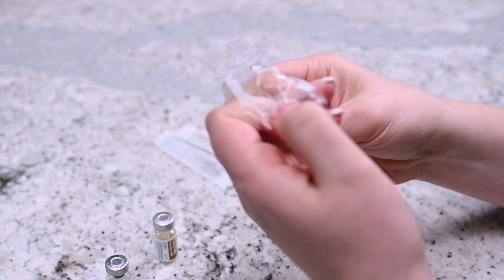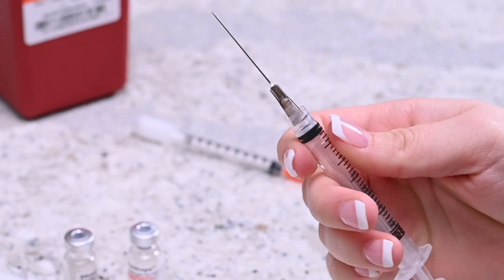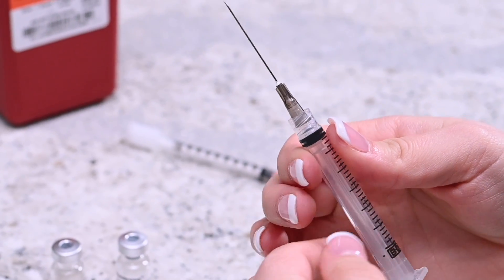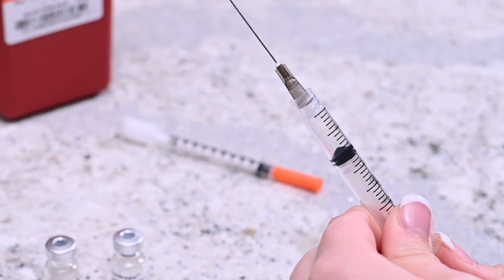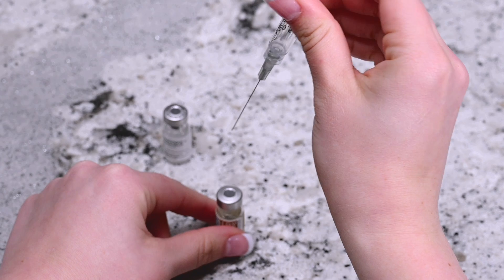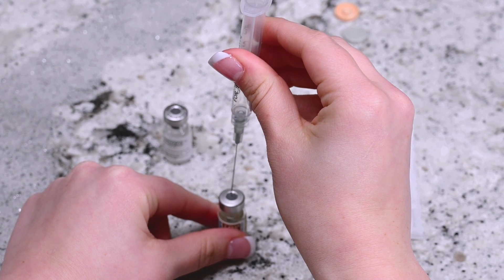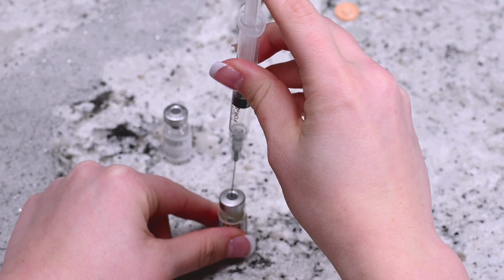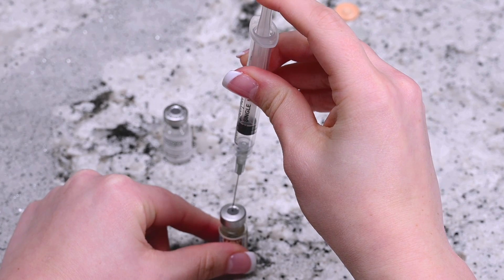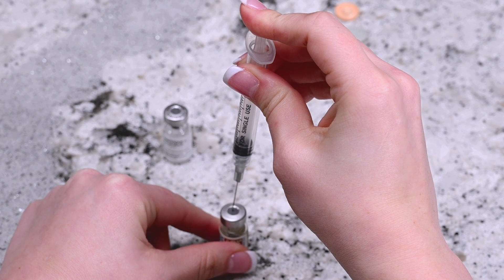Remove the mixing needle and syringe from the packaging and remove the cap of the needle. Hold the needle upright and draw back the plunger to fill the syringe with air. Hold the base of the vial of sterile diluent and pierce the top of the rubber stopper with the needle.